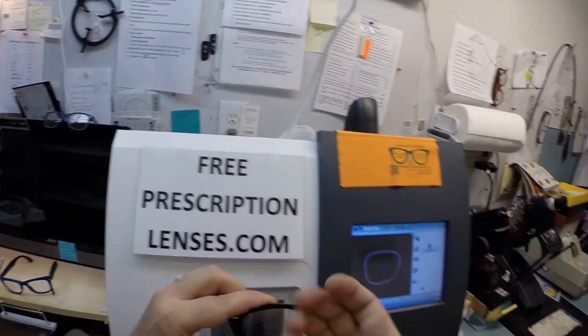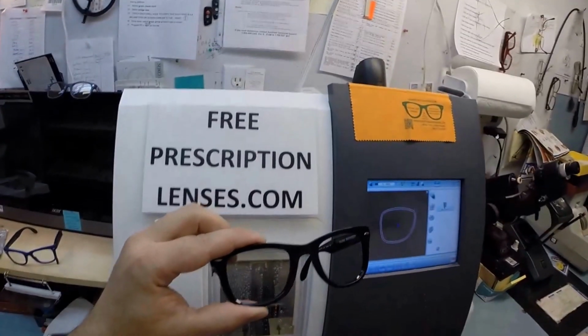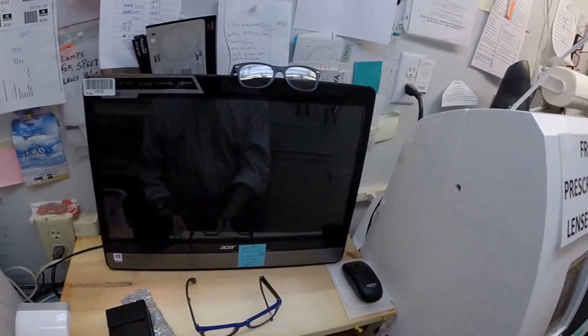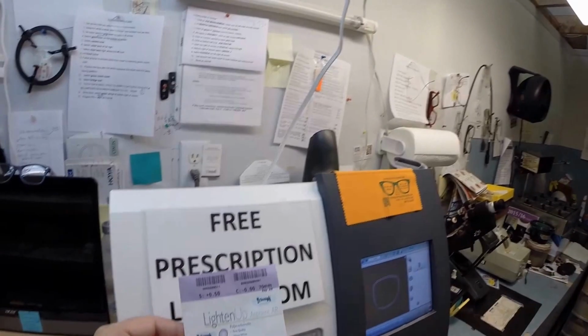If you imagine your frame is like a gutter, if the lens were in there too tight, it would force the bottom of the frame to roll outwards and give you a terrible cosmetic look, as well as shorten the lifespan of the frame. So I don't want to do that. I am a perfectionist. I cut every pair of lenses that get shipped worldwide, so you want a perfectionist like me working on your lenses.